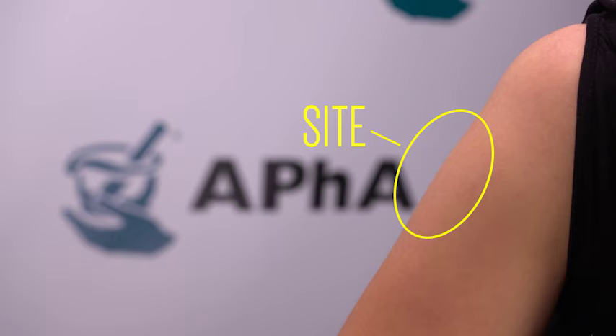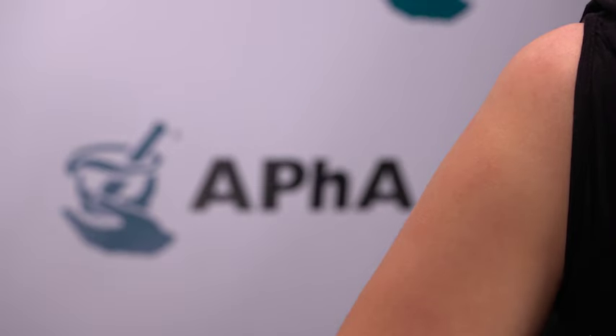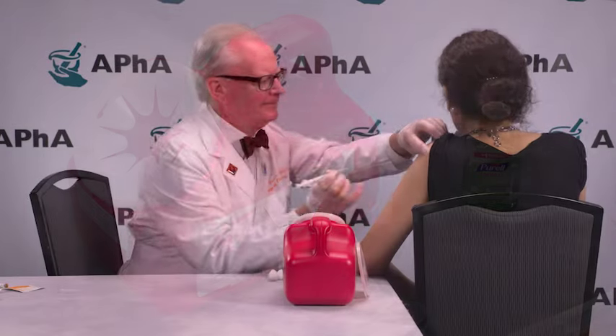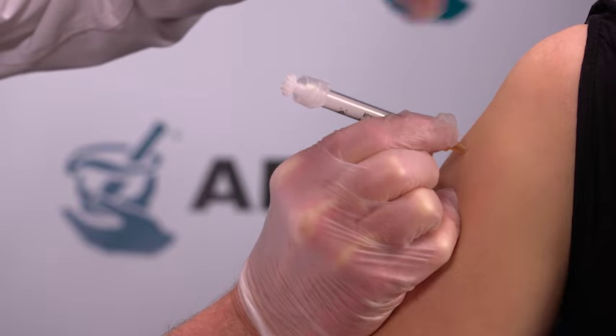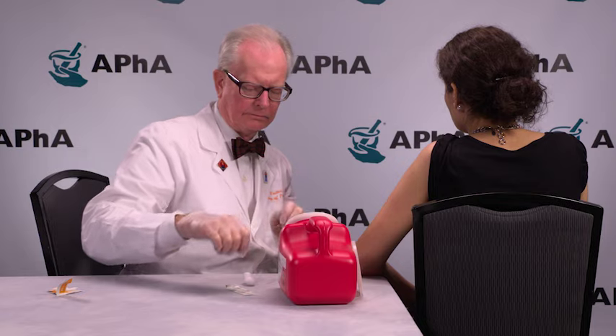Inject the vaccine into the middle and thickest part of the deltoid muscle. Swab the injection site with alcohol and allow the alcohol to dry. Note that the sharps container is readily accessible. Hold the syringe near the hub. Insert the needle at a 90-degree angle all the way to the hub of the needle. Maintain contact with the patient at all times. While supporting the patient and the syringe, depress the plunger in a smooth and coordinated manner. Immediately activate the safety device. Dispose of the syringe and needle into the sharps container.